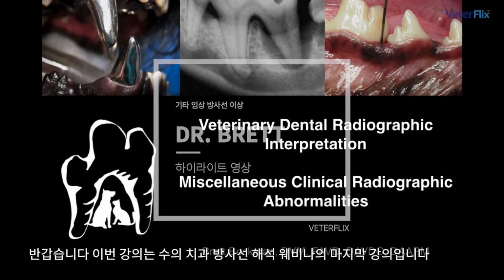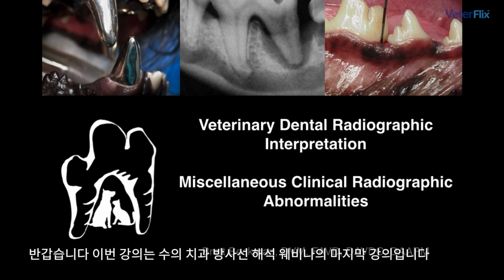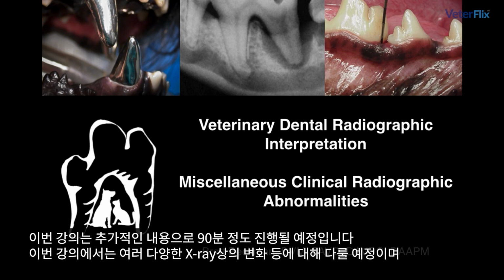Welcome back. This is the last course segment in our veterinary dental radiographic interpretation webinar. This will be an extended session. It'll probably run 90 minutes or maybe a little bit more, as we are going to be talking about miscellaneous clinical radiographic changes, and there are quite a few that we want to cover.